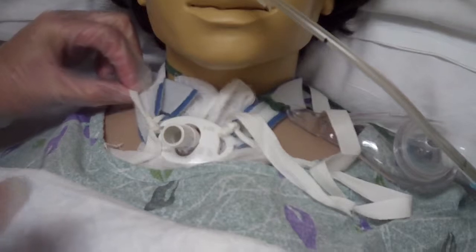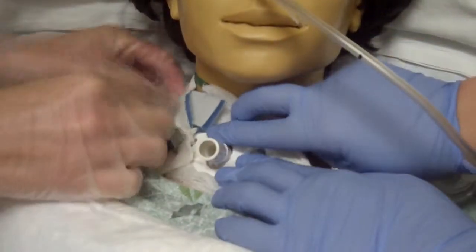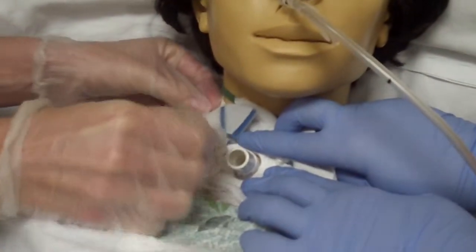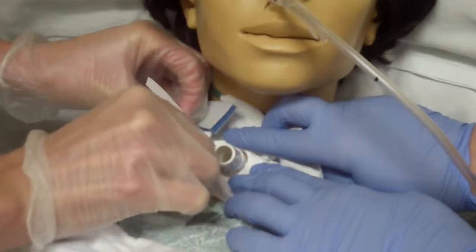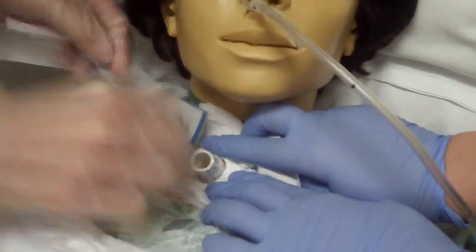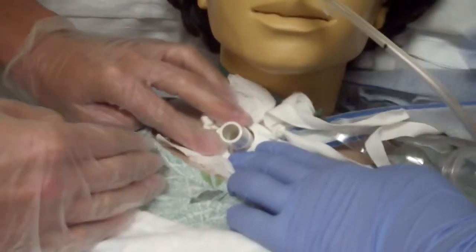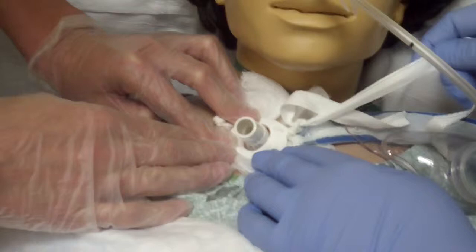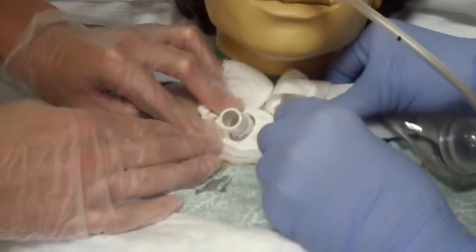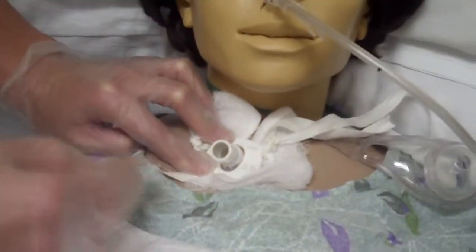So next we are going to remove the old collar, and I'll have Lisa once again hold the plate in place. I'm going to slide that around and have Lisa pull it through the other side, and I will hold the plate while Lisa removes that side. Thank you, Lisa.